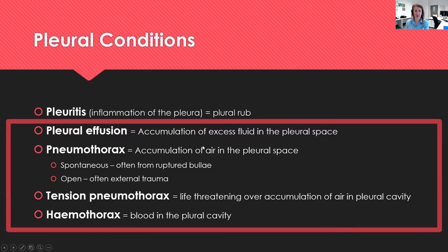So I'll give you an example. A pneumothorax, you'd usually use a Seldinger technique with a small gauge catheter. For something like a hemothorax, you would generally use a very large bore catheter, because we need to allow blood and clots to drain out of that space. And that's usually done using an open technique or a blunt dissection technique.